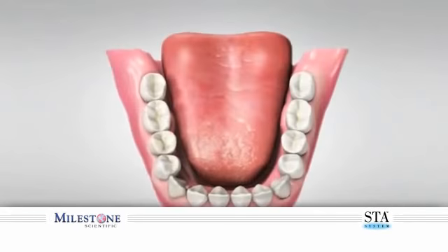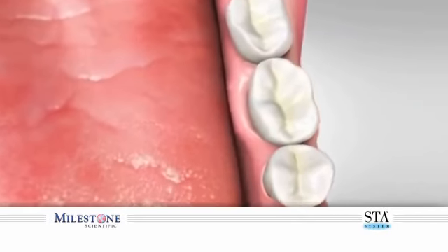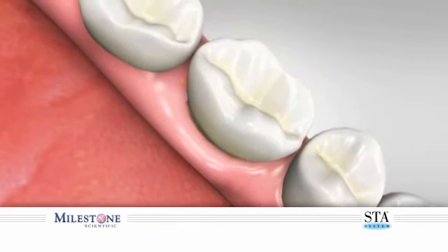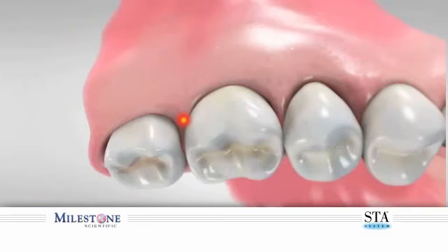When performing the STA-Intraligamentary injection on multi-rooted mandibular molars, it is recommended that 2 sites be used. Always start the injection on the distal lingual root of the mandibular molar, followed by the mesial lingual root. The injection can be performed anywhere from the lingual line angle to the interproximal contact for each root of mandibular molars. For the maxillary molars, it is recommended that you initiate the injection from the distal buccal root, followed by the mesial buccal root. The injection can be performed anywhere from the line angle to the interproximal contact area of this tooth.